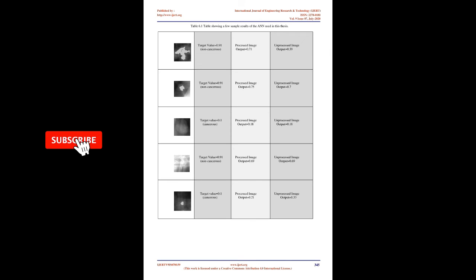Median filter. Image after multi-level thresholding contains salt and pepper noise. This noise is due to the presence of minute grayscale variations in the image. Median filter is a common image enhancement method for removing pepper and salt noise without significant reduction of the sharpness of the image. These filters are most popular because, for certain types of random noise, they provide excellent noise reduction capabilities, with considerably less blurring than linear smoothing filters of similar size. Median filters are particularly effective in the presence of impulse noise, also called salt and pepper noise because of its appearance as white and black dots superimposed on an image.